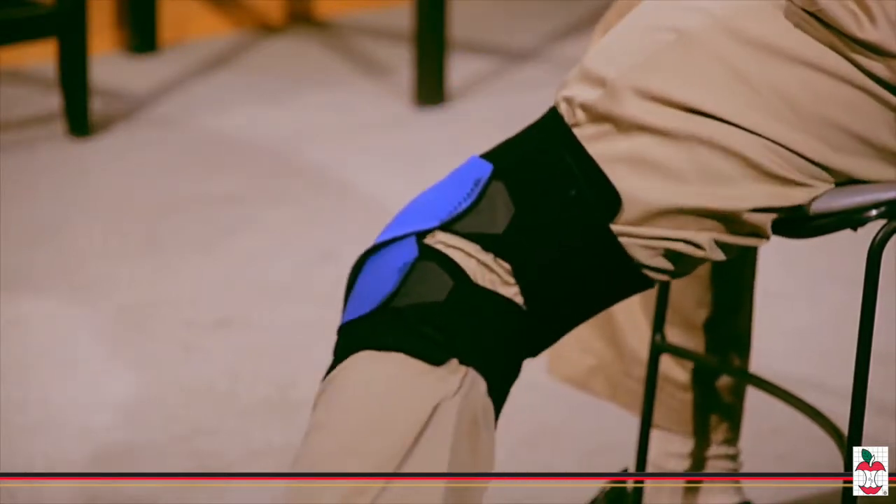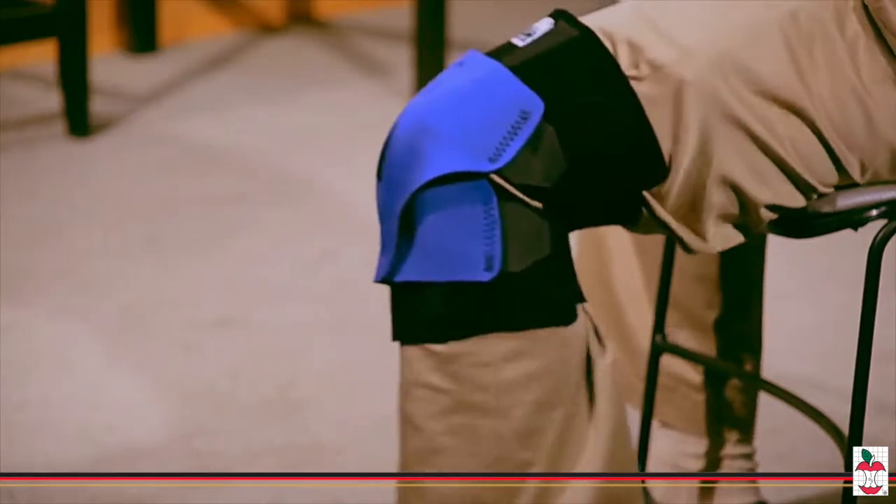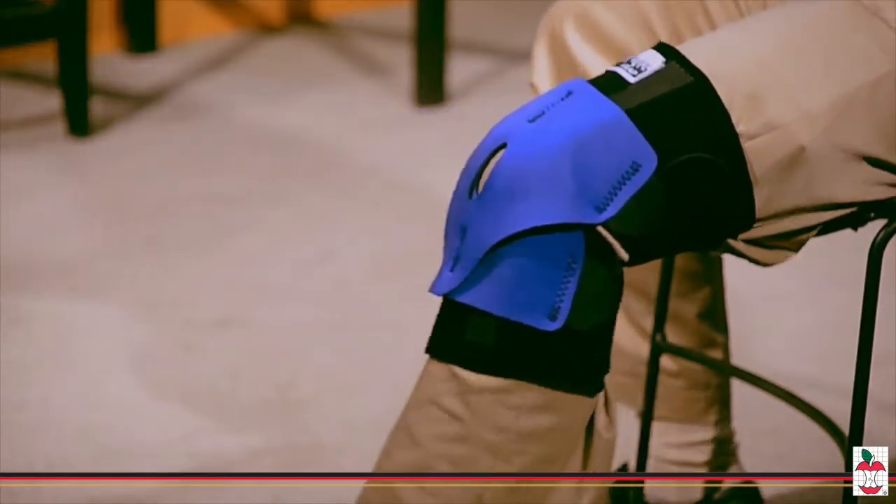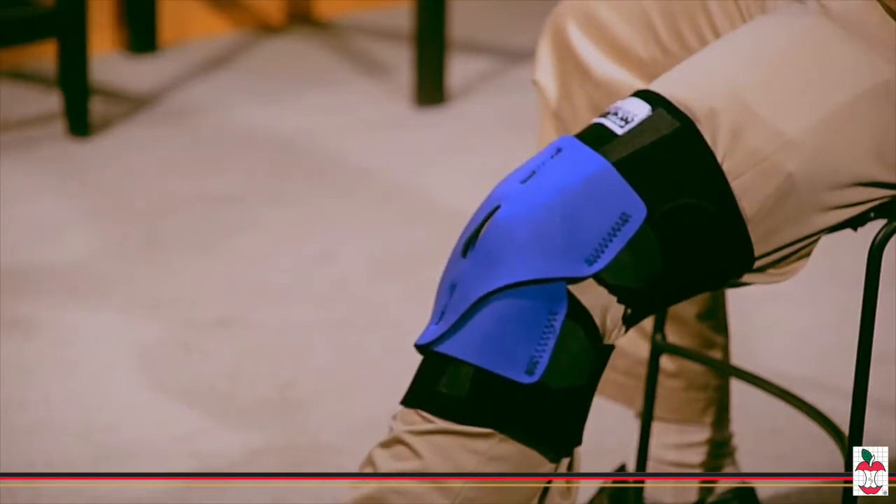The wrap-around design makes it comfortable and easy to wear, even over clothing. It also has a wide popliteal design allowing for better blood flow and is cooler than traditional unhinged braces.